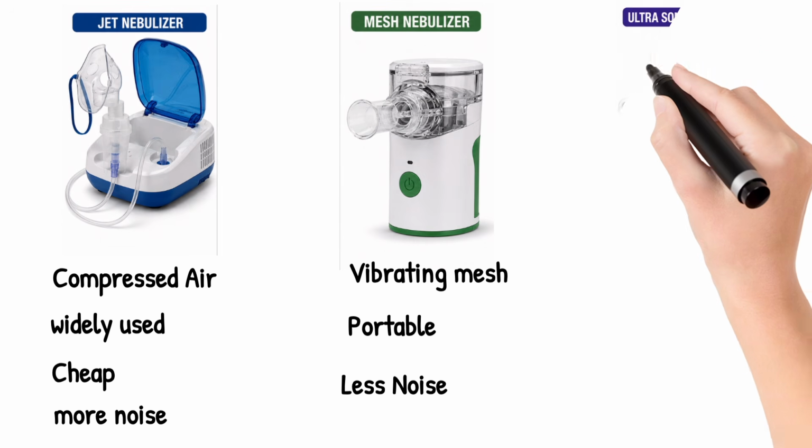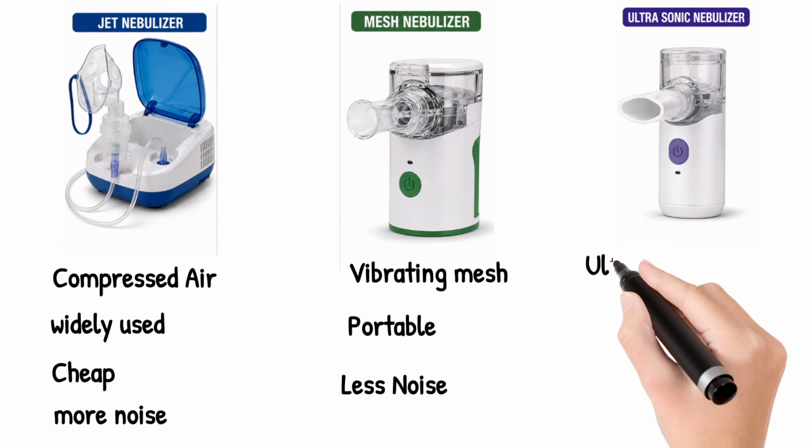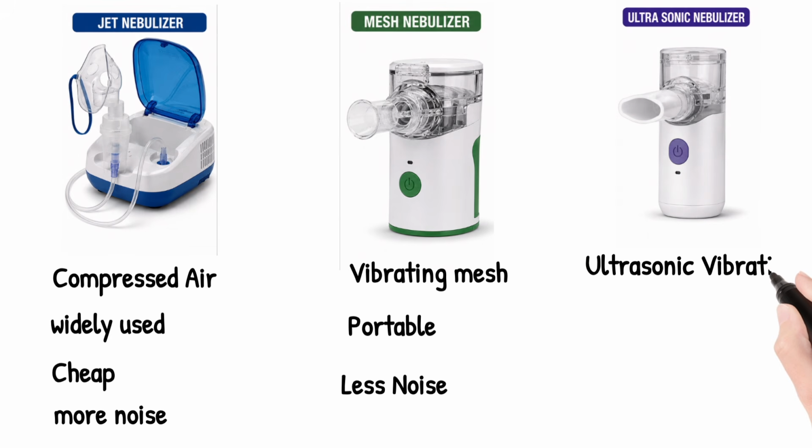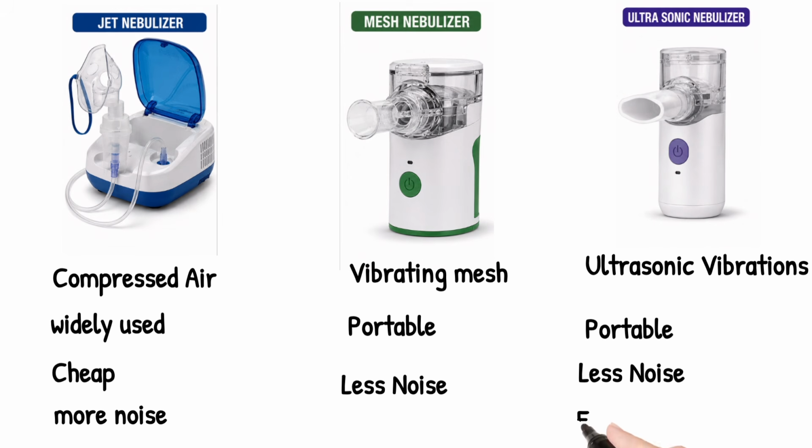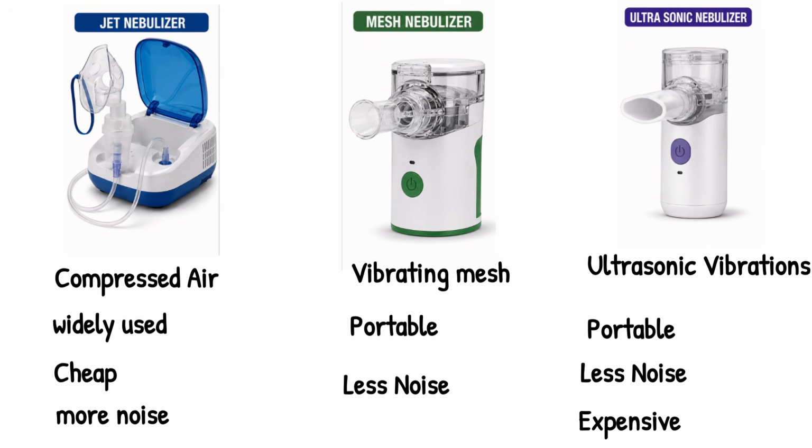Another is the ultrasonic nebulizer. It uses high frequency vibrations to convert the liquid medicine. Less noise is there, but it is much more expensive, costly.